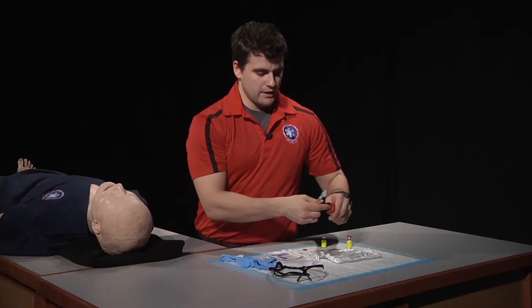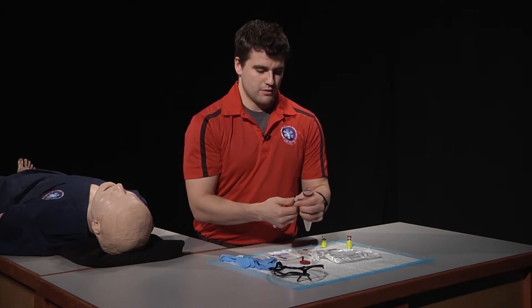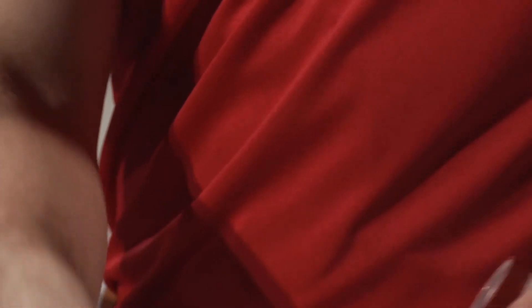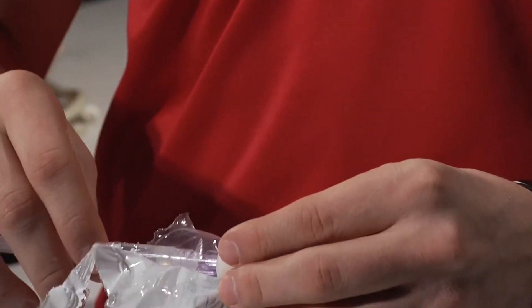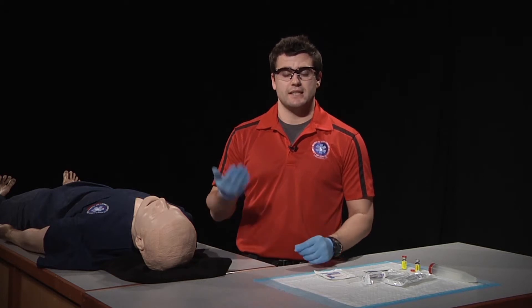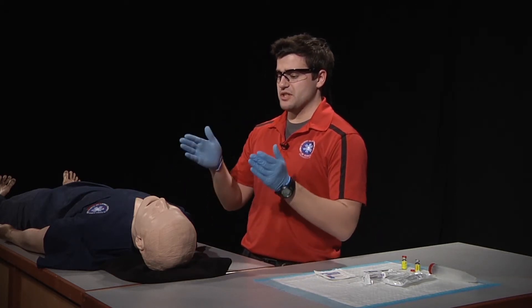We will then immediately sharps the needle and reattach our syringe to our mucosal atomizing device, also called the MAD. After applying the appropriate PPE — which in this case is eye protection and gloves — we're going to direct the partner to cease ventilations.